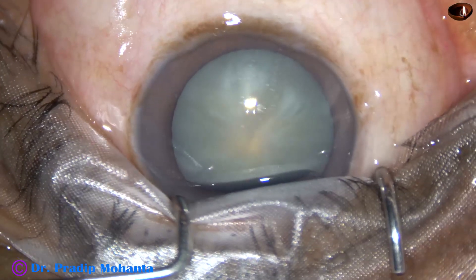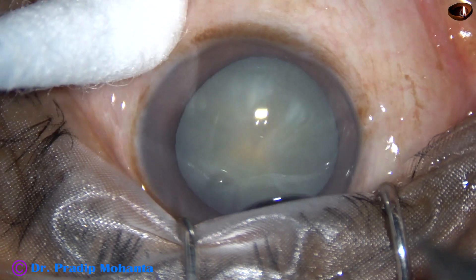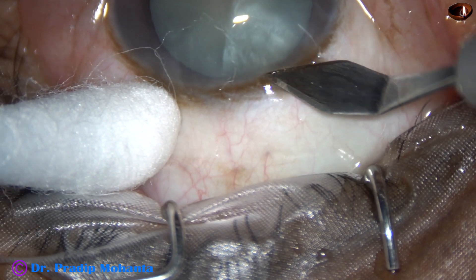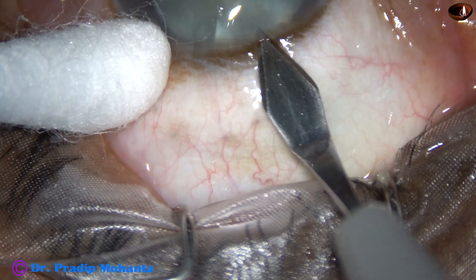This cataract appears like an intumescent cataract. We can see some fluid pockets inside this cataractous lens and there is convexity of the anterior surface of the cataractous lens. Let us observe this surgery.